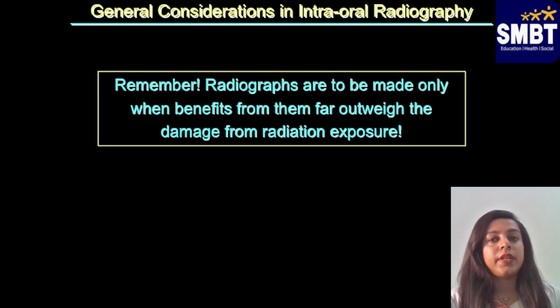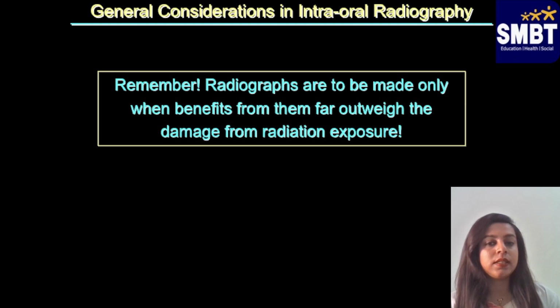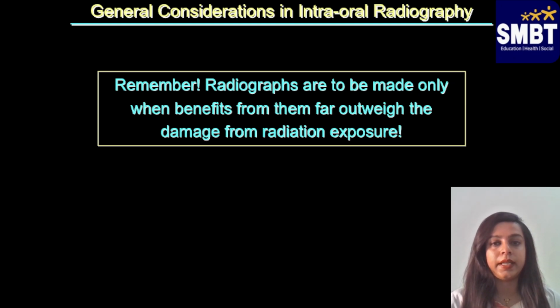Now remember, radiographs are to be made only when benefits from them far outweigh the damage from radiation exposure. Now we'll take 2 minutes to try to understand what this sentence means. It means that it's absolutely important to know when and where we should be using a radiograph. X-rays are not a luxury, and you shouldn't expose yourself or the patient whenever you want to. So if there's an intense need, then only we should be heading for a dental X-ray.